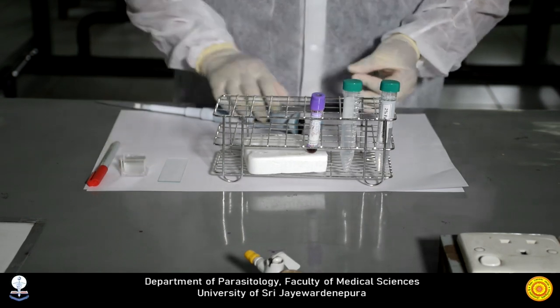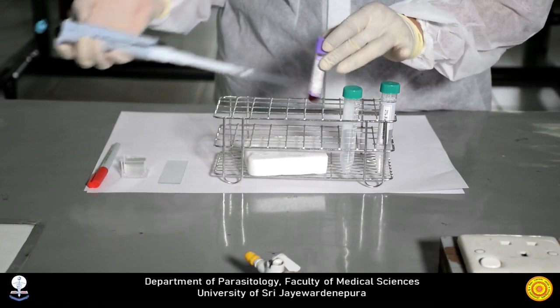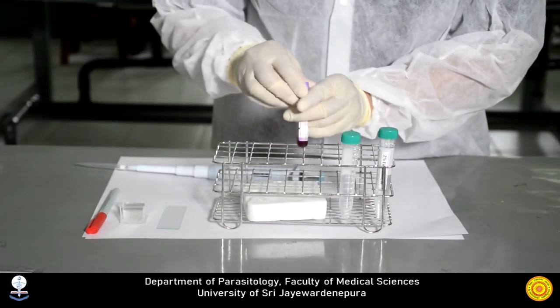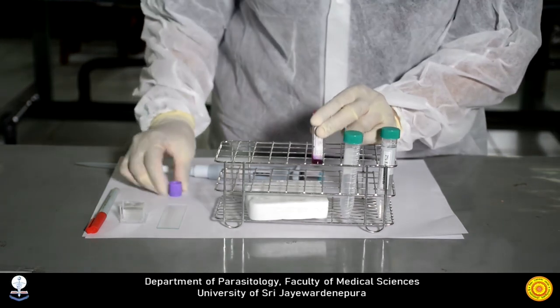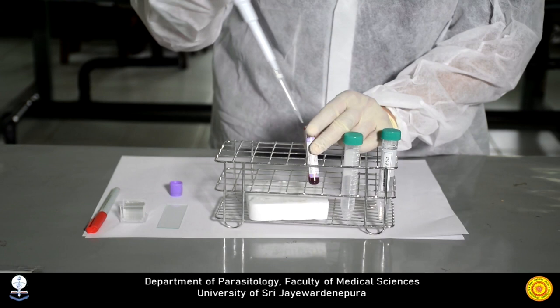So let's get started. This procedure is called Knott's concentration technique. Here we are going to mix 9 ml of 2% formalin with 1 ml of venous blood.